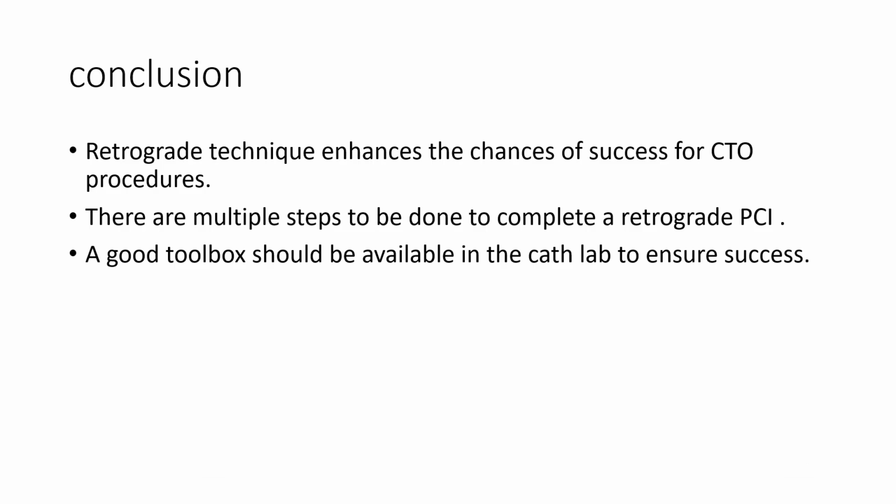In conclusion, retrograde technique enhances the chances of success for CTO procedure. There are multiple steps to be done to complete a retrograde PCI. A good toolbox should be available in the cath lab to ensure success.